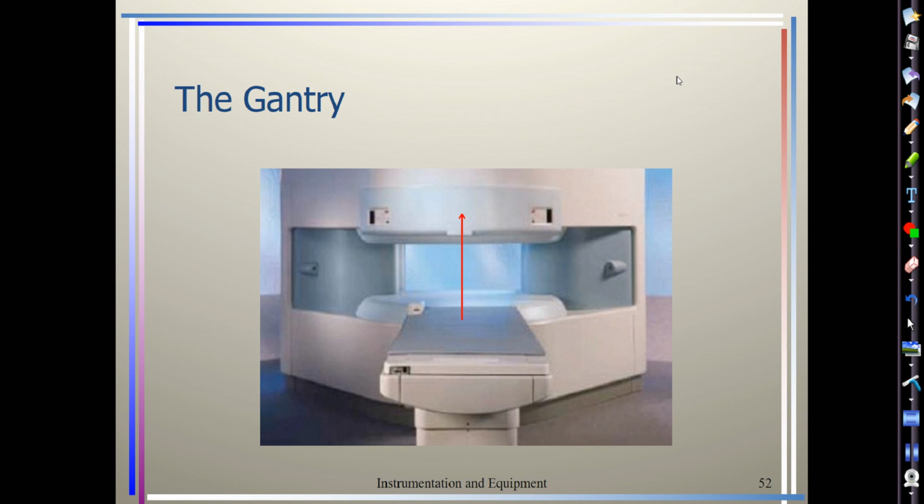Desmond, you have a question? Claustrophobic, any type of, say, IR procedure where they need to insert those catheters while they're imaging, or any type of actual movement imaging, so maybe you have to flex the bicep tendon as you're imaging, relax it, flex it. All those types of studies would be great with an open system.